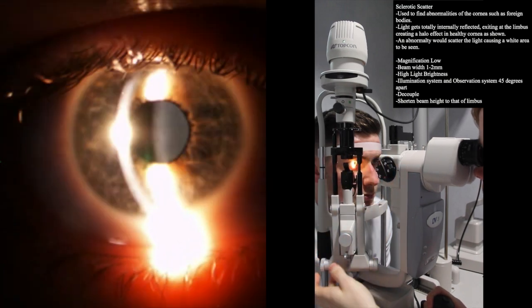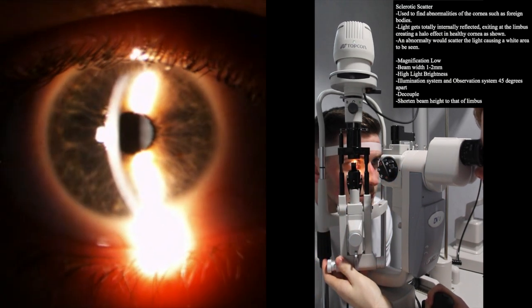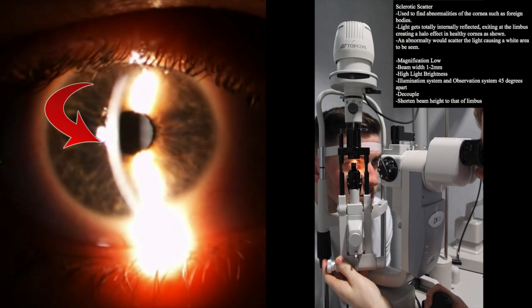Place the beam on the center of the cornea, then move the joystick until the tear debris is in focus. We then need to decouple the slit lamp.